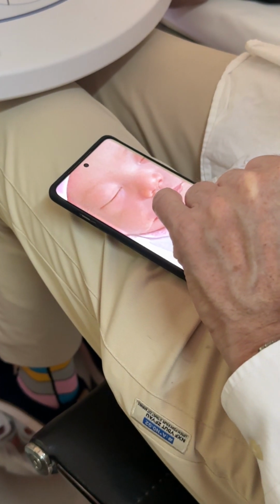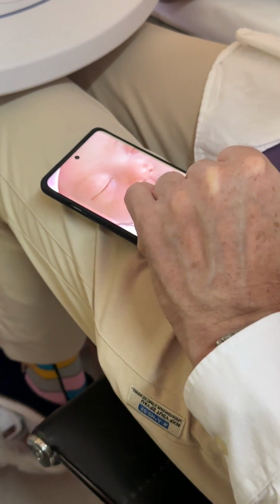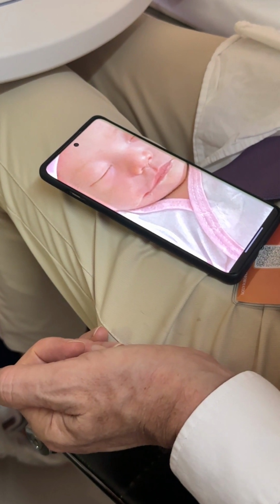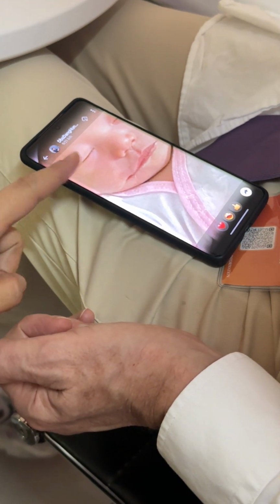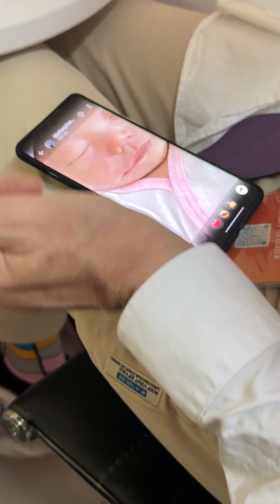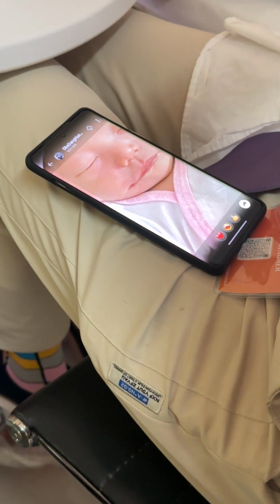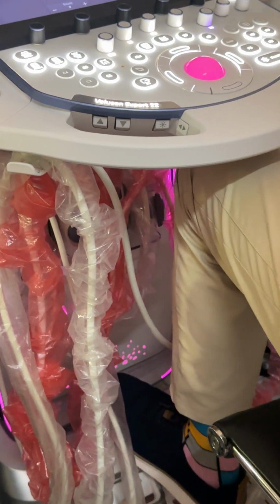Were there any amniotic bands? No. Does this look like a defect from an amniotic band? Just one abnormality on the lip, not deep. That frequently is an amniotic band, a small amniotic band that affects the face. Maybe. How to pick this up with ultrasound?